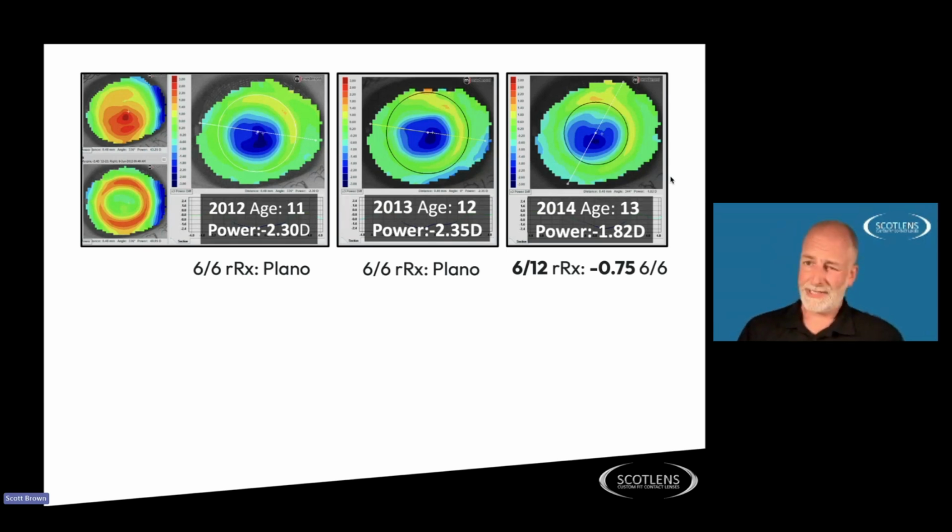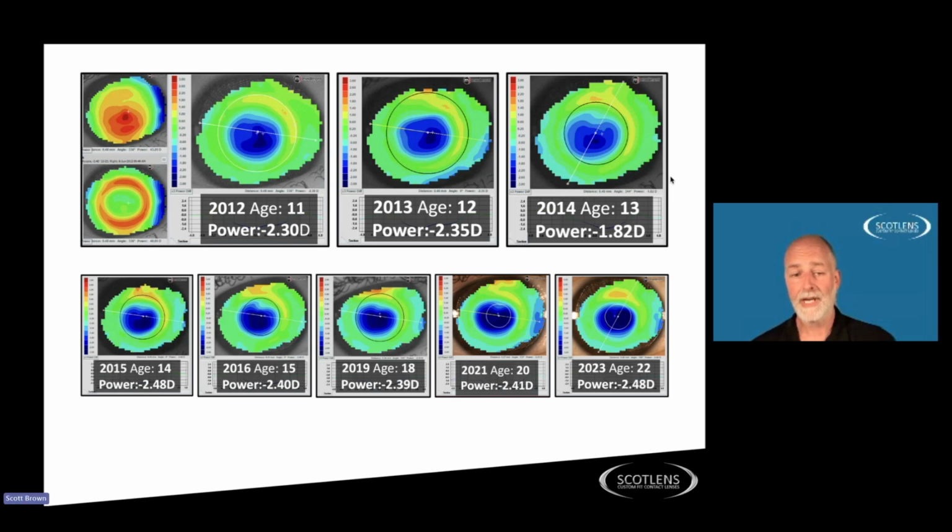So at this point, I then sort of pushed the question a bit more with the patient. So did you definitely wear your lenses last night? This is a Saturday morning appointment. And the patient confesses, no, I didn't wear the lenses last night. So at this point, I knew that the undercorrection was there because they hadn't worn the lenses, although they had said they'd worn the lenses the night before. But the topography was my polygraph test on that day to reveal that they were lying.